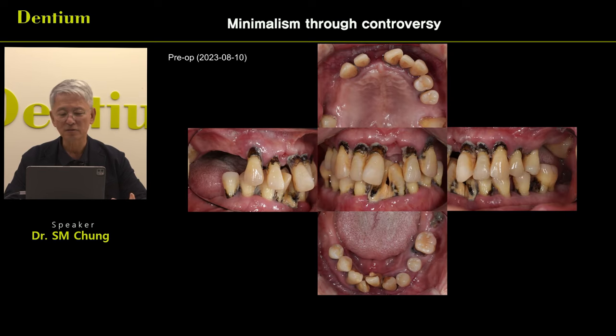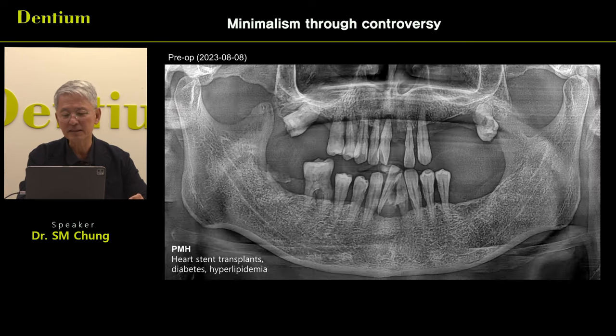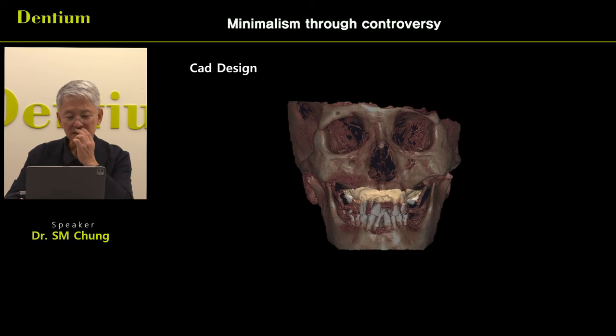So at first we are trying some bite CT bite. Instead of leaf gauges, because leaf gauges cannot be used with the gauze bite, only anteriors, and with that stabilization, we take a combined CT, with the stitching, intraoral scanning, and the STL from the DICOMs.